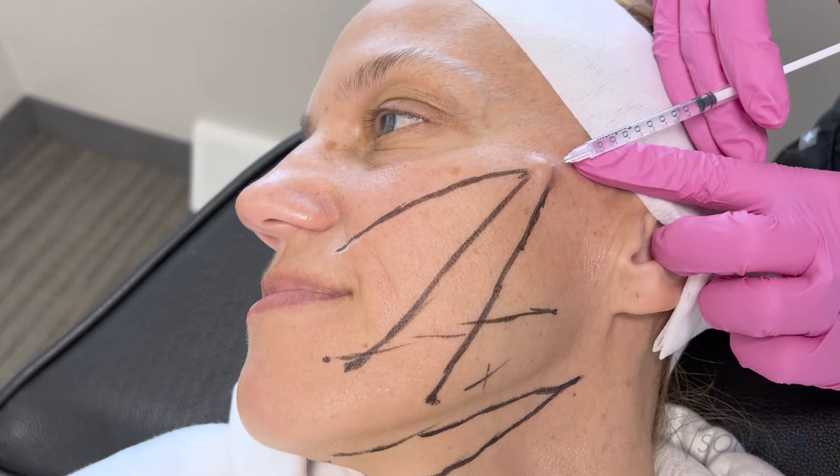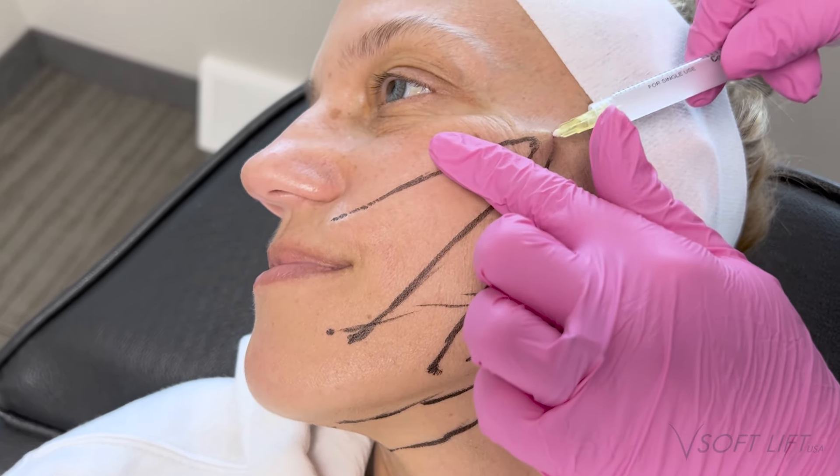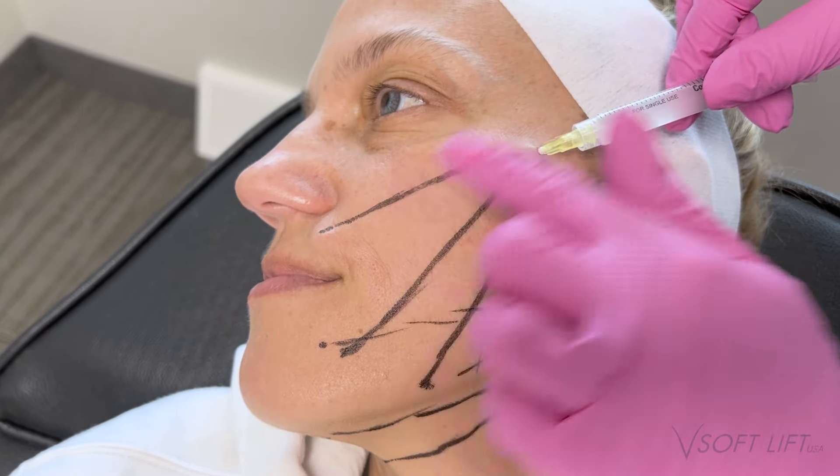Starting off, I'm going in with lidocaine with epi and making my initial pilot hole. I like using epi at the insertion site — it helps control bleeding. Now I'm going in with my 18-gauge pilot hole, as we're using an 18-gauge cannula today. Once I insert my needle, I tent up a bit and assess my depth. This is the most important step of placing threads — if you start that initial vector too superficial or too deep, that is the plane your thread is going to follow.